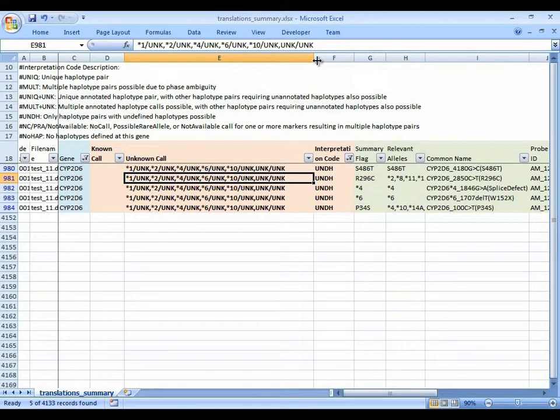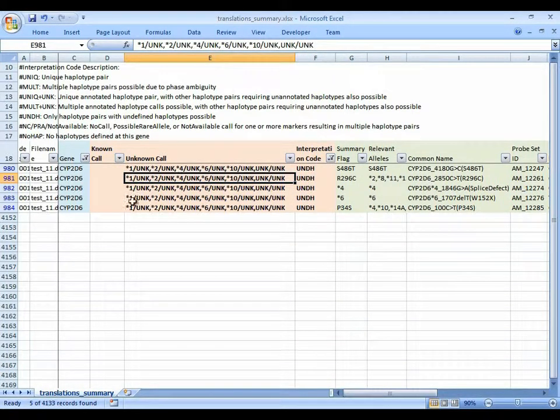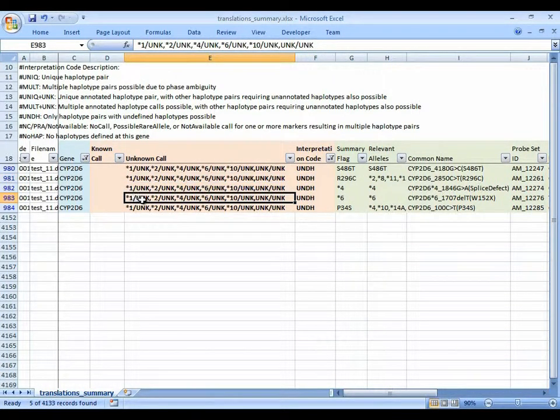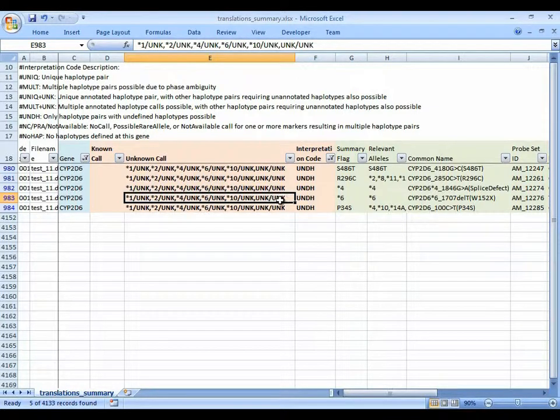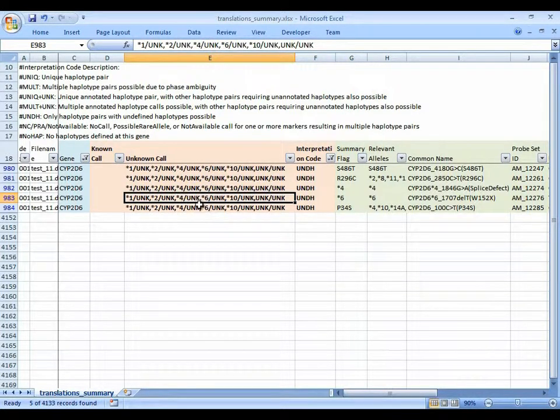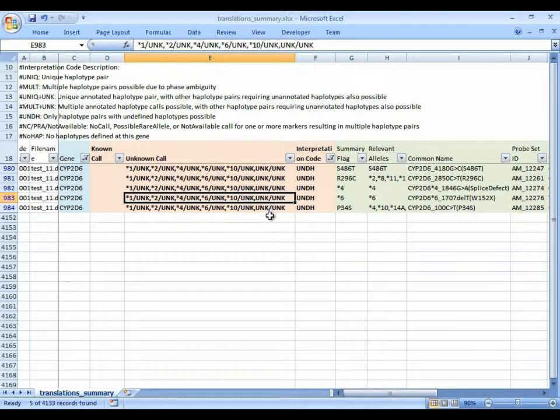And, the unknown call field kicks in as being valuable. Let's see what we got here. So, based on the pattern of observed genotypes, it could be any one of the following comma separated diplotypes. It could be star 1 plus an unknown haplotype, star 2 plus an unknown haplotype, star 4 plus an unknown haplotype, star 6 or star 10 plus an unknown haplotype, or a combination of two haplotypes that aren't defined in the translation table.